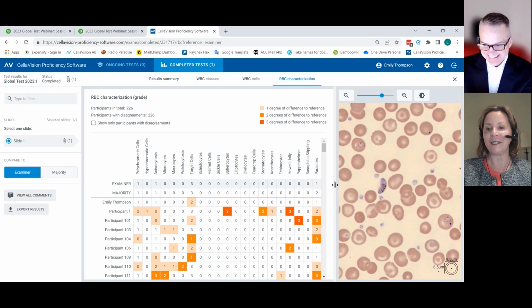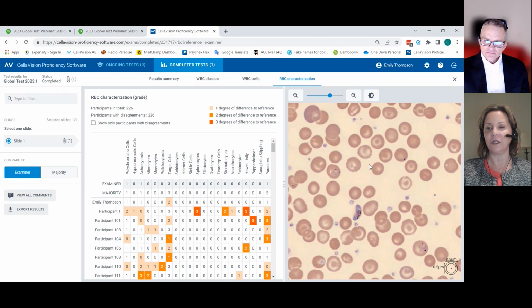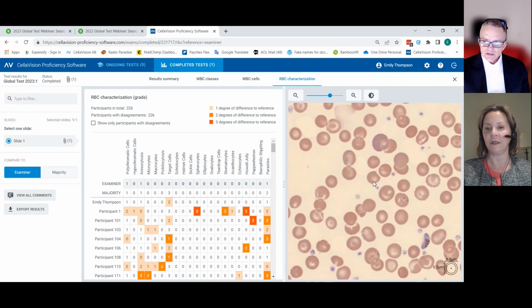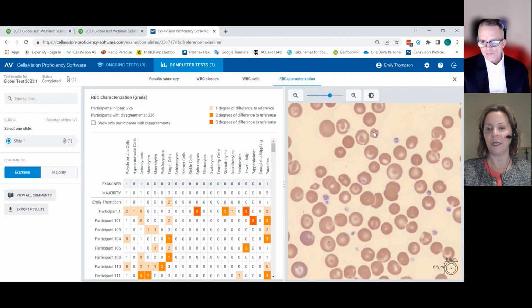Over on the right-hand side here, you can see the red cell view from this patient. To answer that person's question, yes, there were ringforms here. Can you see my pointer? Yes, you can. Some here, and Steve showed the cell that actually had four in it. I'm not sure where it is, but as Steve pointed out, there's another one there.